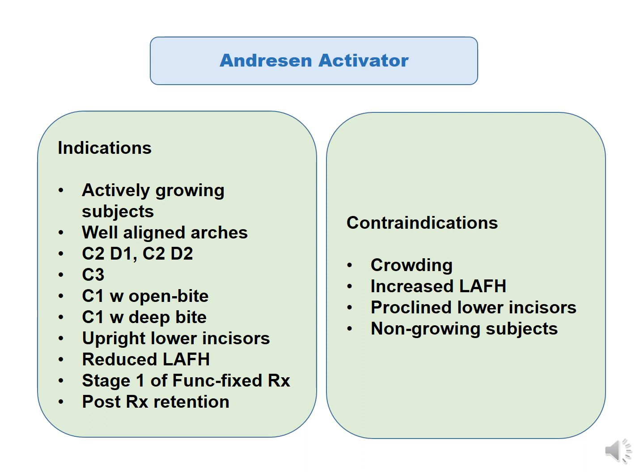Now, the contraindications: the Andresen activator is contraindicated in an arch that is crowded, contraindicated in subjects with increased lower anterior facial height, contraindicated if the lower incisors are proclined, and not suitable for non-growing subjects.